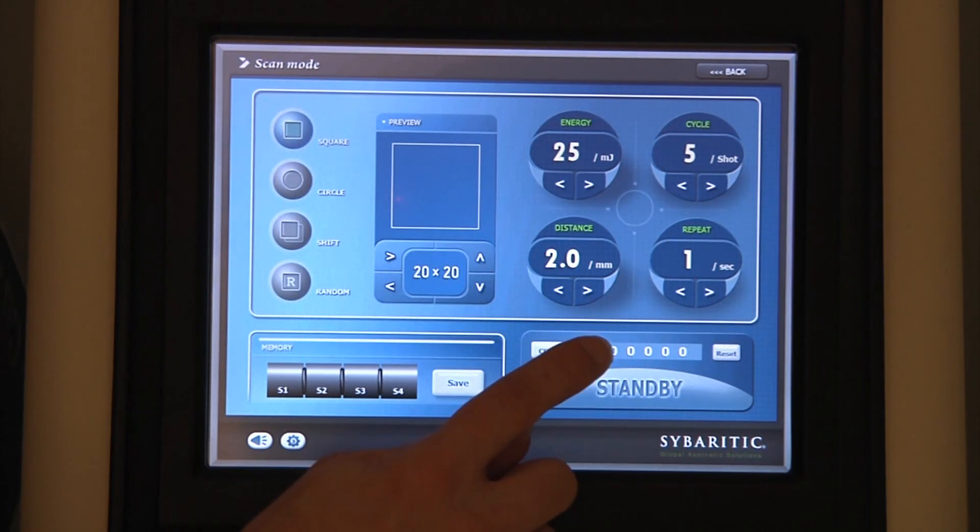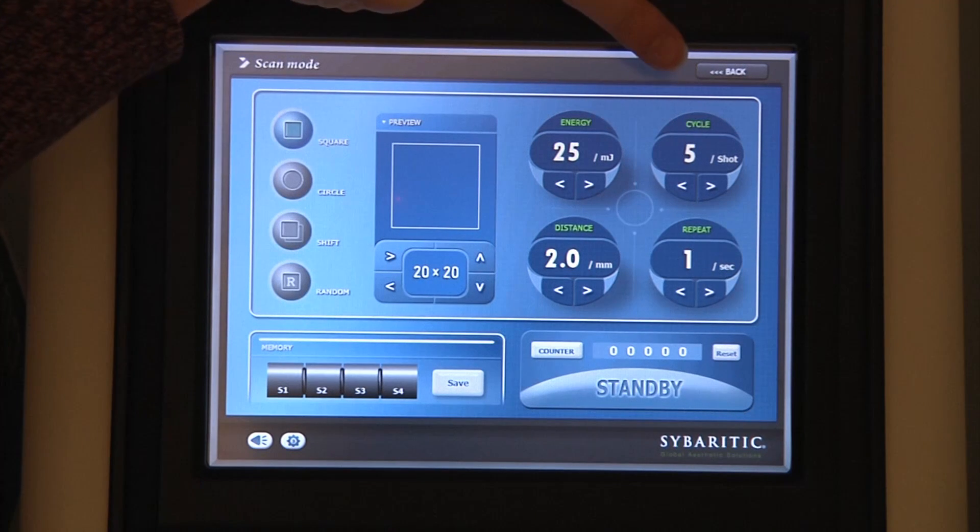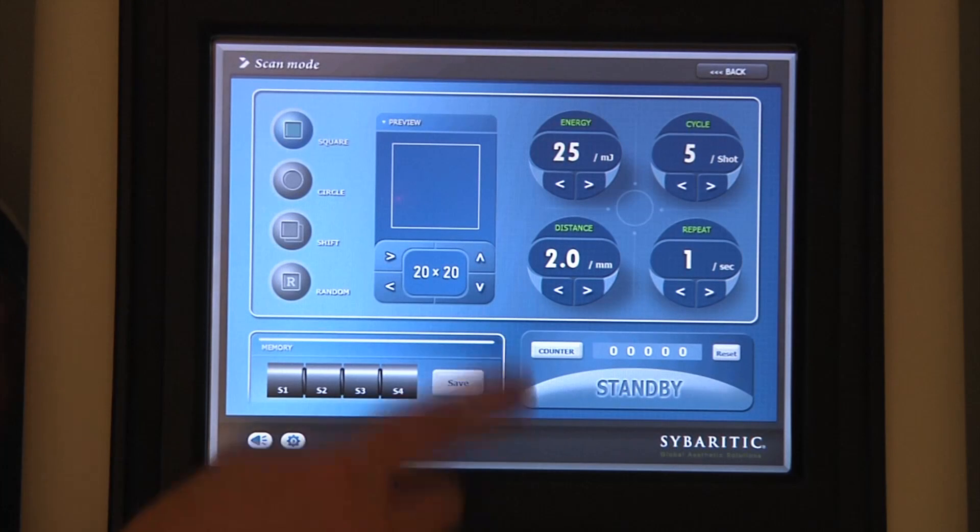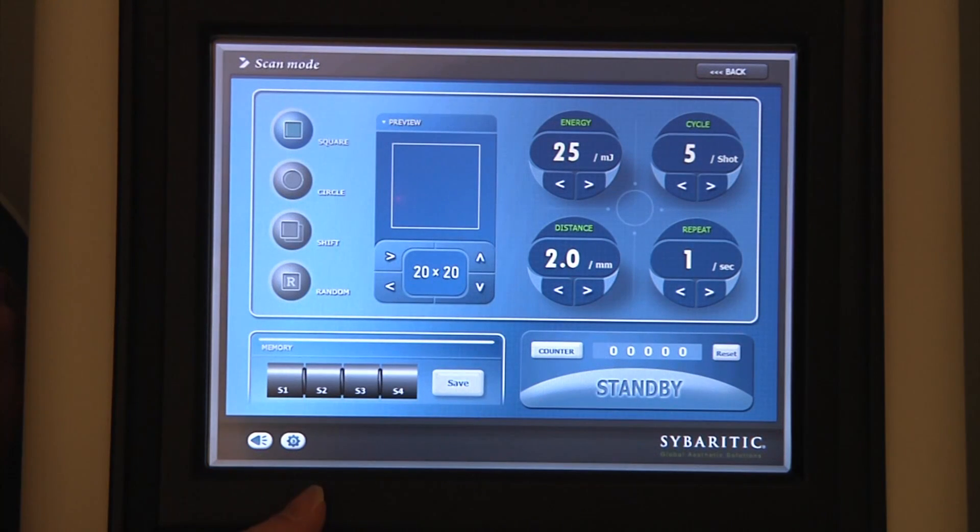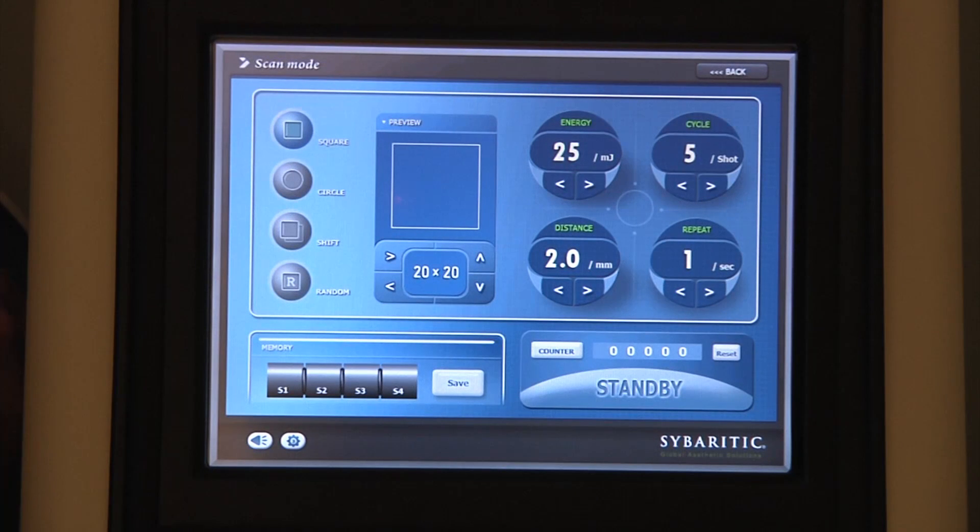Over here, we have the energy control. We can adjust the energy from 15 millijoules up to 25 millijoules. We can also control the cycling from 1 to 5. The distance indicates the distance between individual microthermal zones, which we can set as tight as 400 microns or as wide as 2,000 microns or 2 millimeters. The repeat mode is essentially our cycling frequency, which we can adjust from 1 to 3 cycles per second.